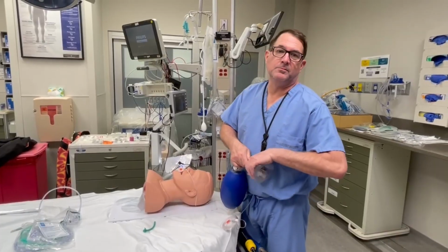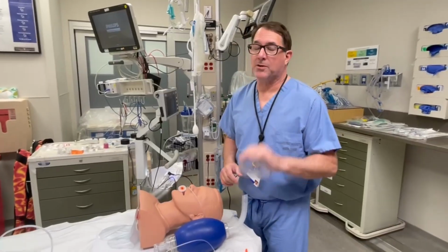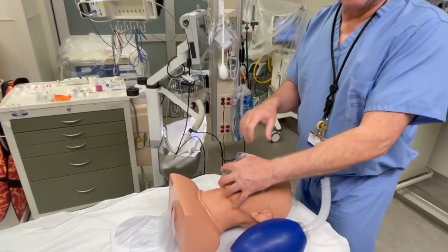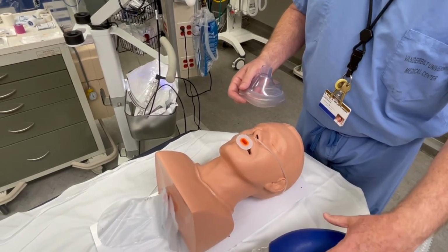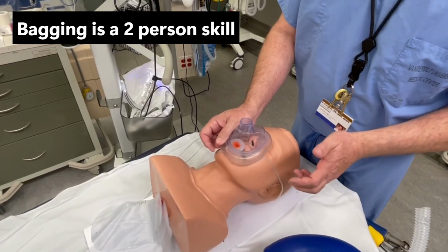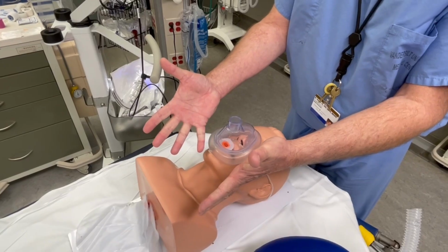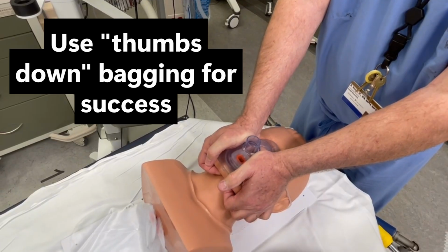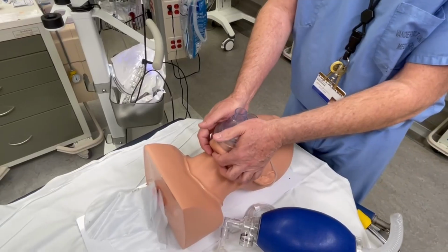Then, I don't care who does it, but somebody needs to do mask seal, not one-handed. You learn from anesthesia this whole one-person bagging thing, and that's all great, but in an elective environment, that tends to work really well. Here's what works every time: two-handed mask seal with your thumbs pointed down. These eight fingers are lifting the jaw, you're pushing the mask into the face like so, and then you have another person squeezing the bag.